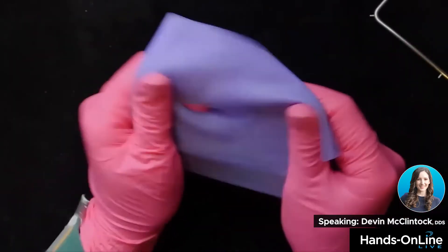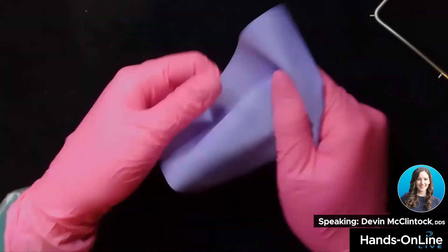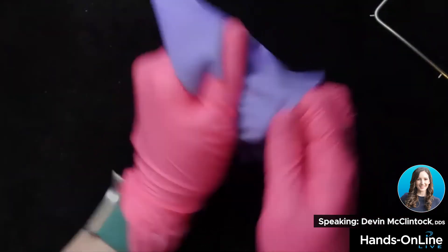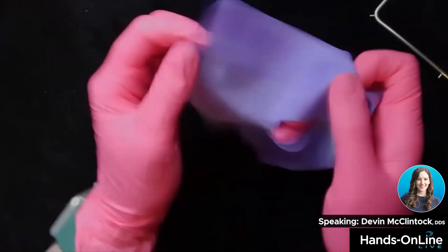When you have a rubber dam, you want to stretch it — I usually recommend stretching it before you punch it. You want to stretch it just to get it elastic. It doesn't take much time, you don't have to do much, but just stretch it out and give it some give so that way it doesn't tear on you.